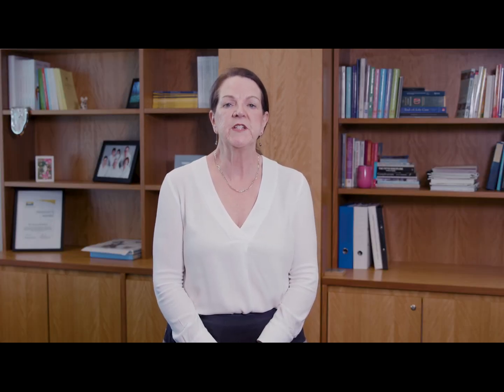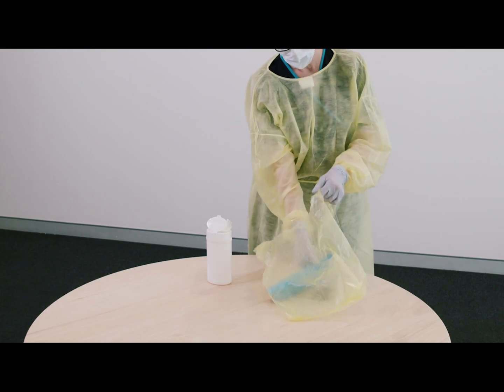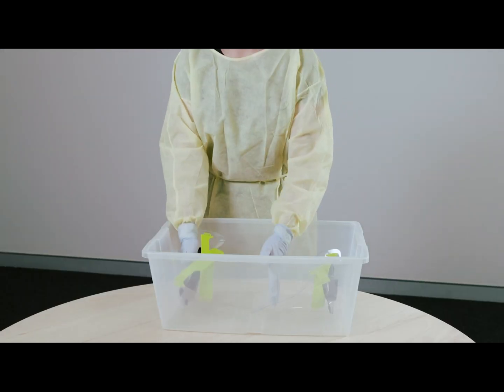If the shield is disposable, you must dispose of it safely and immediately after use. If the shield is reusable, place it in a bag or container to be transferred to an area where it can be disinfected. Once you've removed the face shield, hygiene your hands.